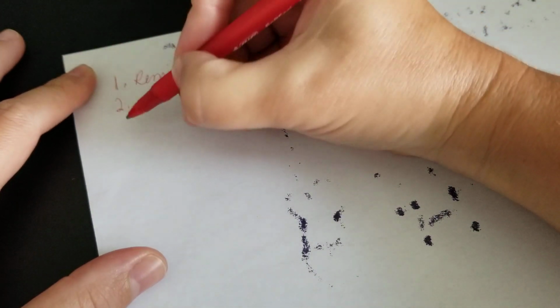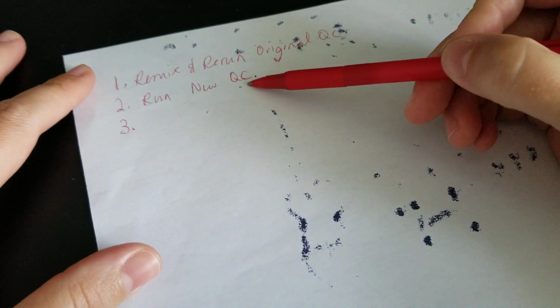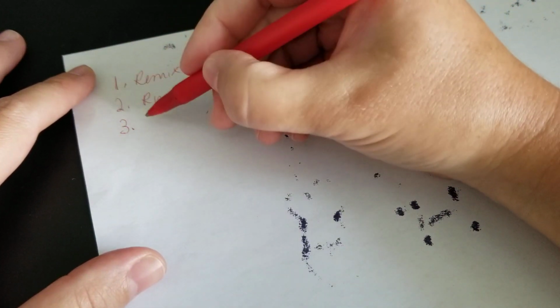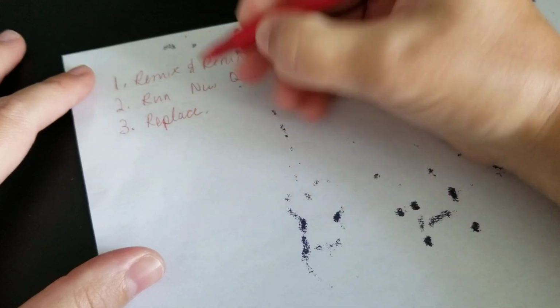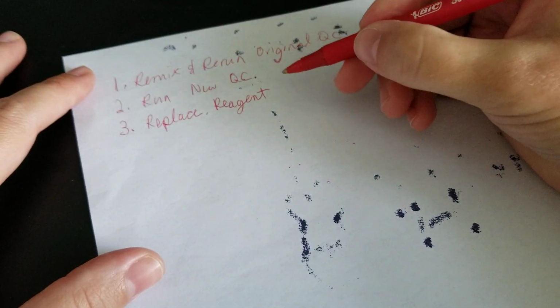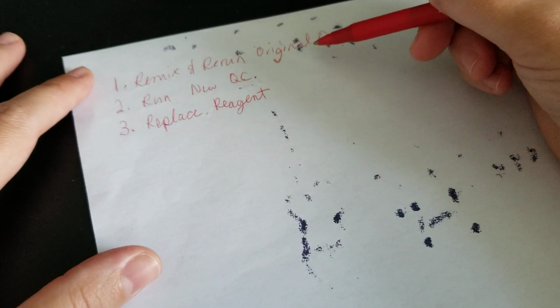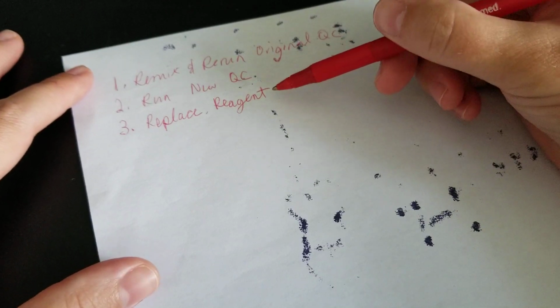All right. So if the QC was still out after you replaced the QC with a new one, then you're going to end up looking at the reagents. So you could replace the reagent and run this QC that you already put on there, okay? So it may be that the same thing that happened to this QC happened to the reagent, all right?